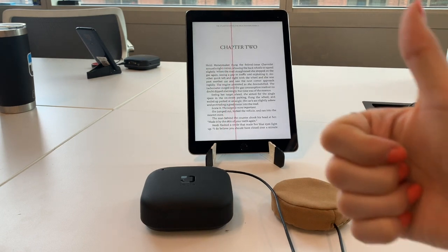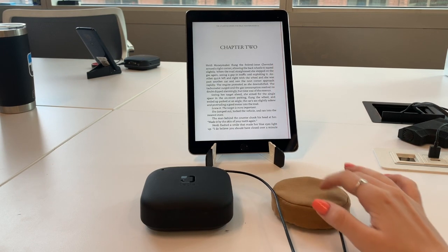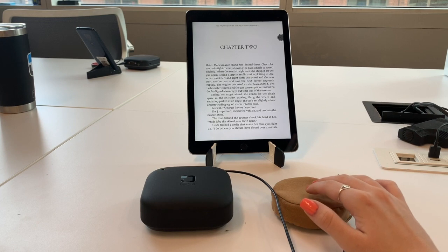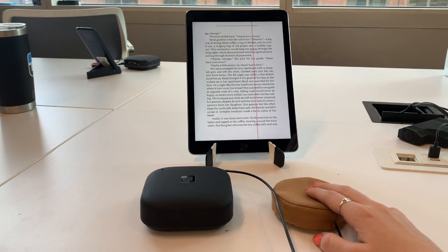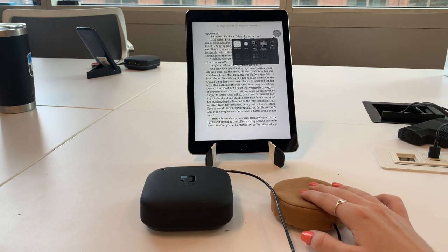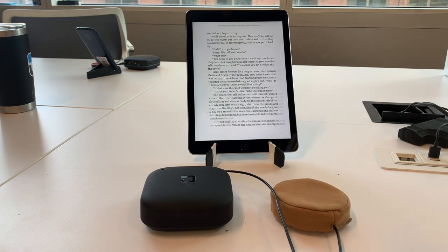Thumbs up! You have navigated through chapters. To turn pages in point scanning, try to align your lines on the side of the page of which you would like to turn. Reading with point scanning can get annoying, so let's change it back to item mode. Just like as shown in the beginning, with a slight tap of the switch, it'll allow for a page turn.